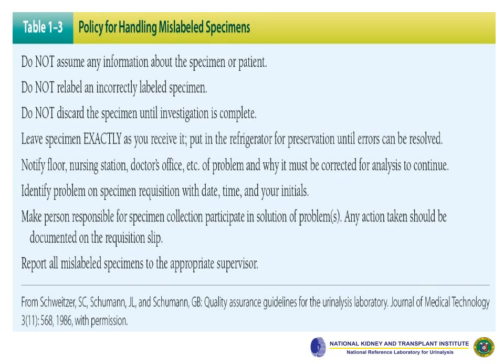Each lab should have a written policy for handling mislabeled specimens, such as this. Do not assume any information. Do not relabel. Do not discard until investigation is complete. Leave the specimen exactly as you received it.